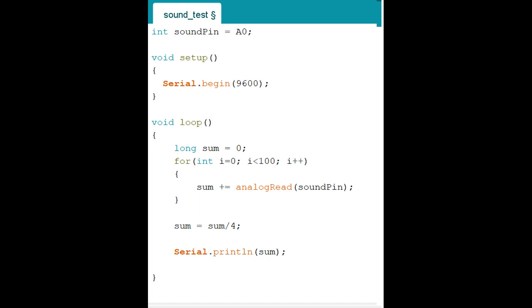i plus plus means i keeps increasing one by one, and since it's less than 100, you stop at 99. So that's the condition. It goes by initial value, then less than 100, and then how much to increase, which is one by one. After you've done that, enter, and then you put a brace. That tells the computer, okay, under that condition, I'm doing something again.